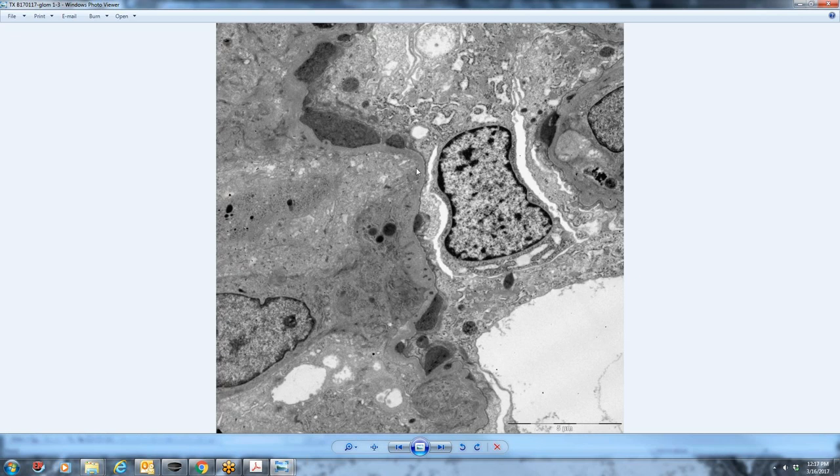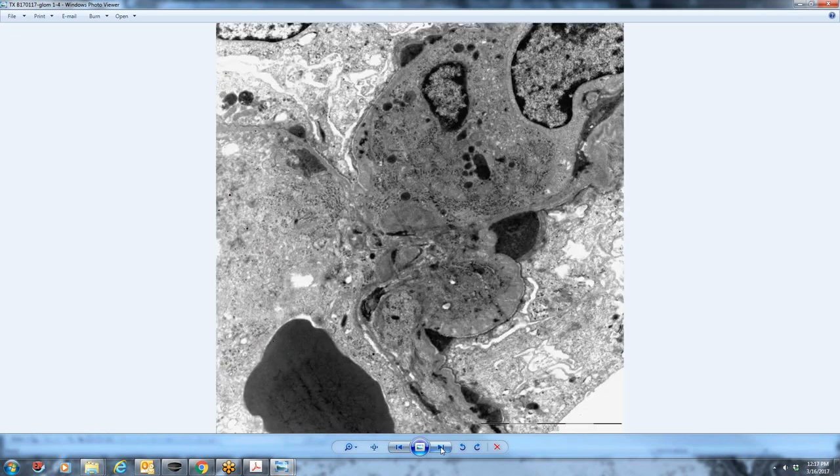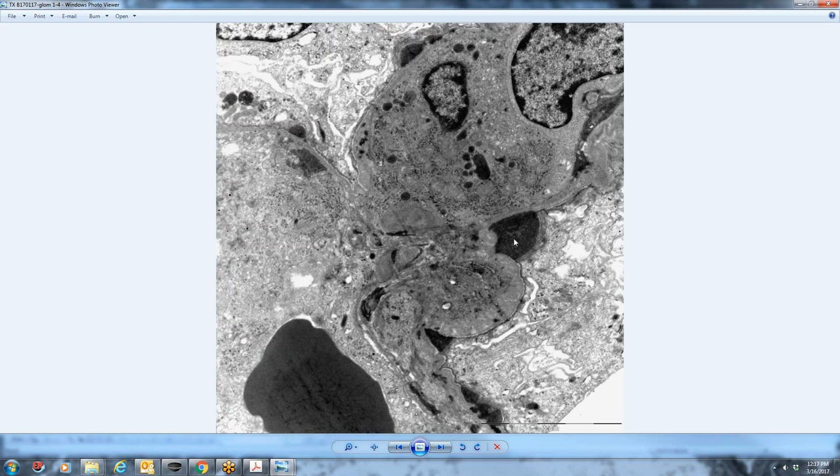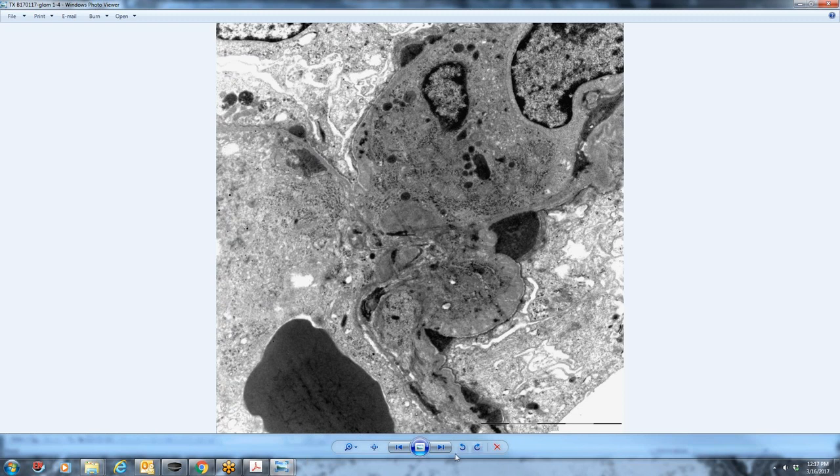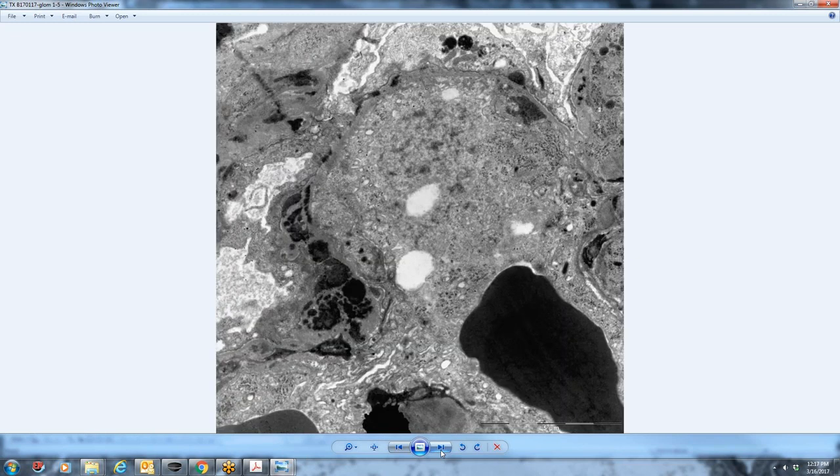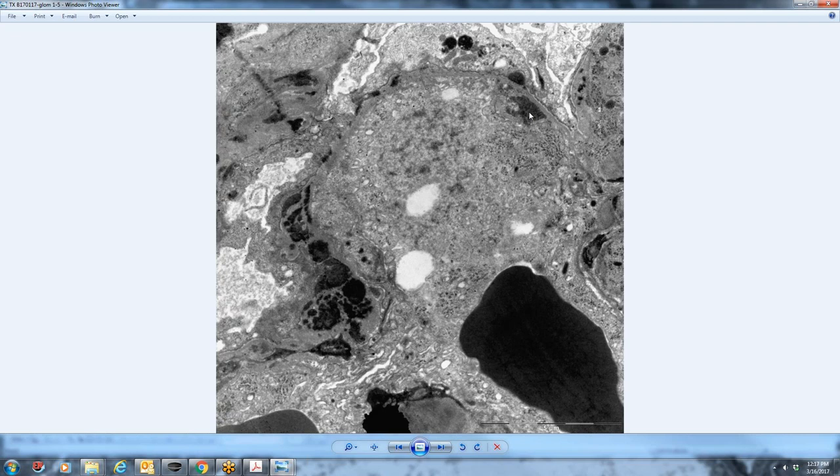So all of these would be kind of similar to what we see with the C3 deposits in a human with humps of that material. They like to sit right here in the neck of the mesangium and the capillary loop. And then even so, we still have a little bit of sub-endothelial material as well.